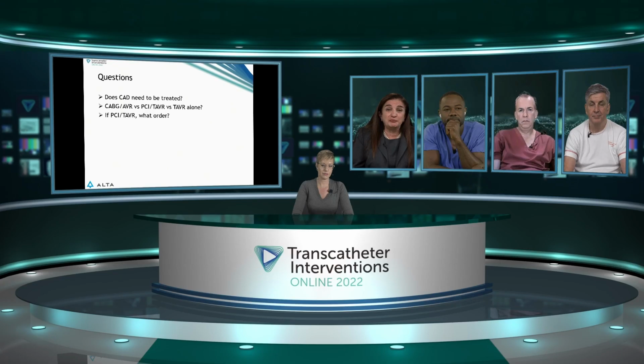I mean, I guess you could think about, those are both pretty tight lesions. Whether you do it before or after, it all depends on what valve you're choosing, what's the height of the coronaries, and especially in that anomalous one off of the cusp of the right. So I personally would say, and I also, by the way, I think I saw a little bit of an MR on that echo.